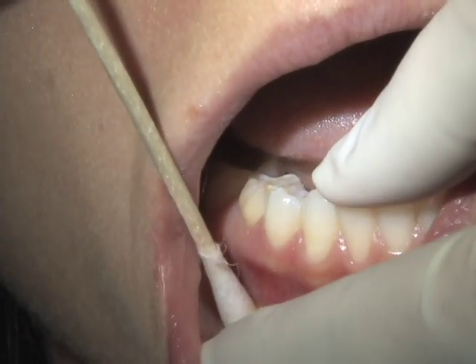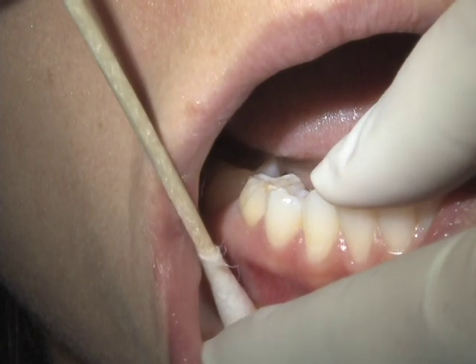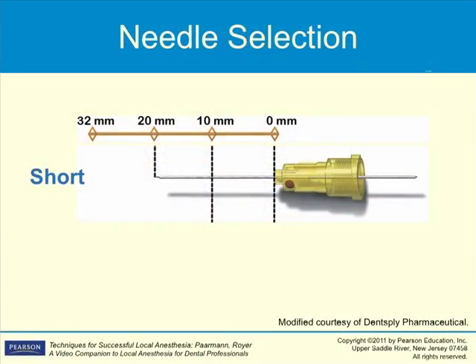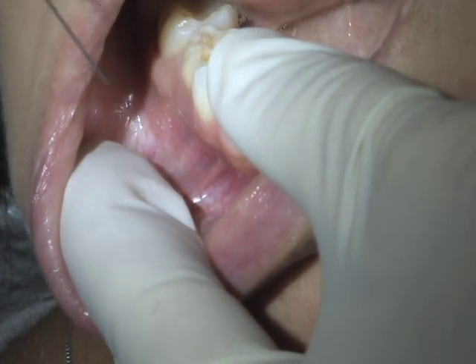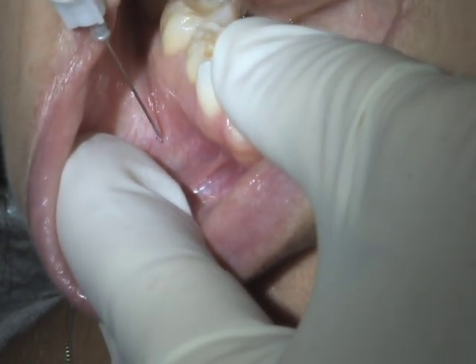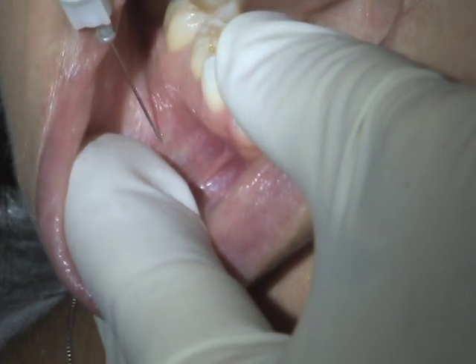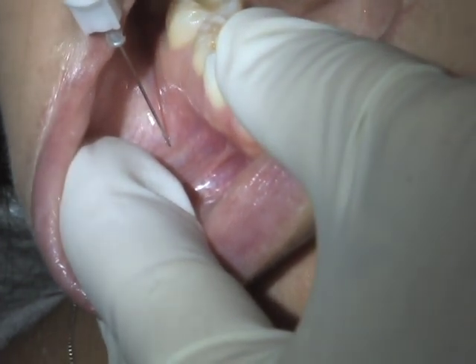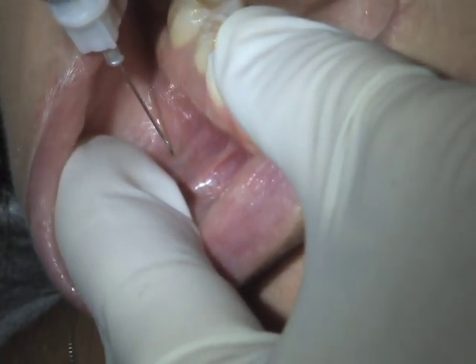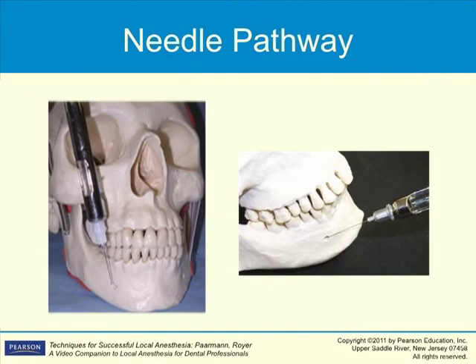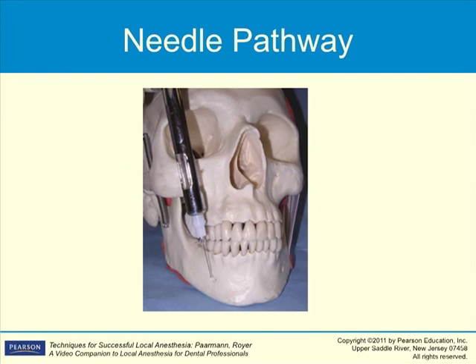Place topical anesthetic for one to two minutes over the mental foramen. A 25 or 27 gauge short needle is used for either of these injections. Retract the lower lip and buccal soft tissues laterally to locate the penetration site. The bevel of the needle faces the bone and tissue is pulled taut. The penetration site is slightly anterior and superior to the mental foramen.